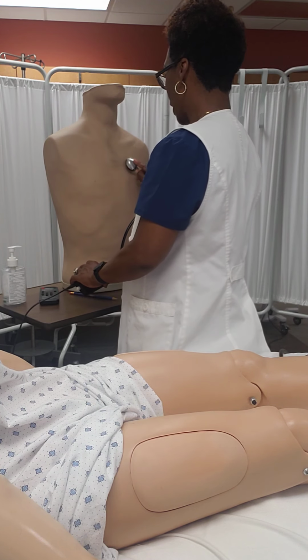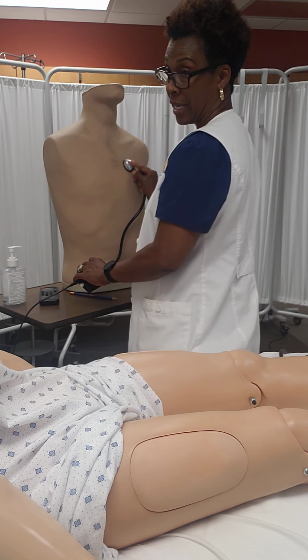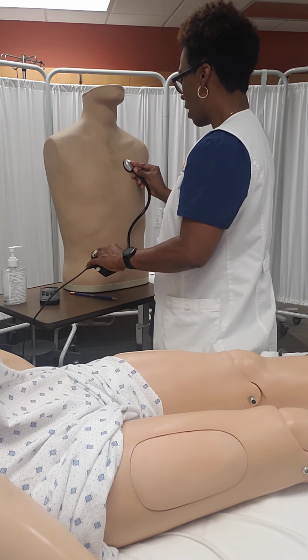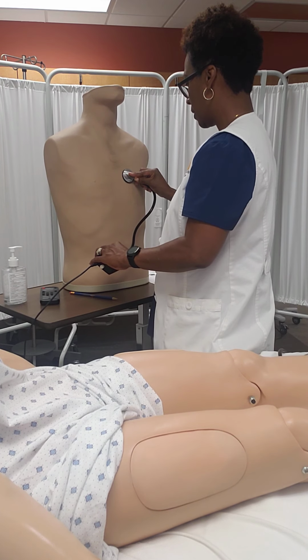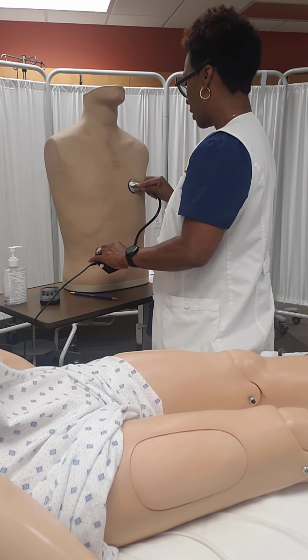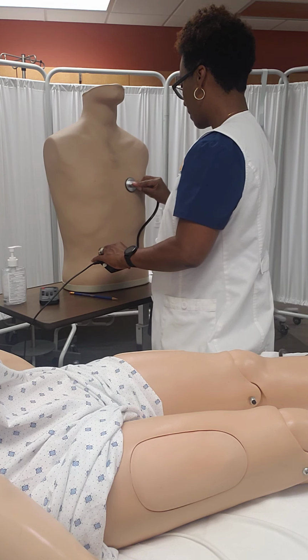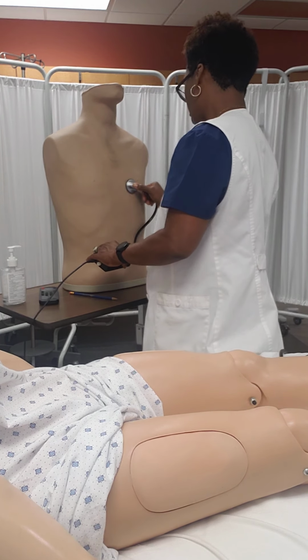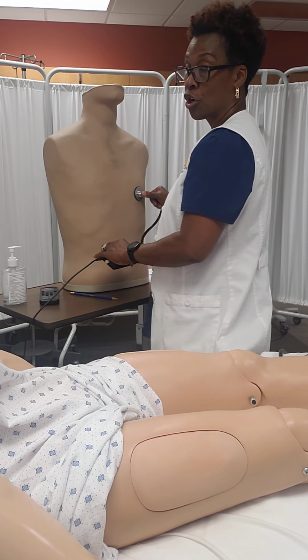If I go directly across the sternum, I should hear the pulmonic. And on this torso here, you might be able to hear all the rest of them. Tricuspid. Oh, look at it. You have Erb's point, tricuspid. And let's see if I can get it. Here you go, you hear it there. And then your mitral.